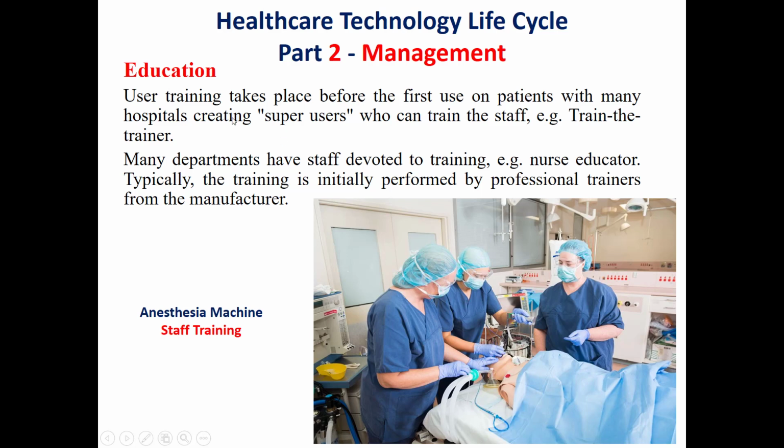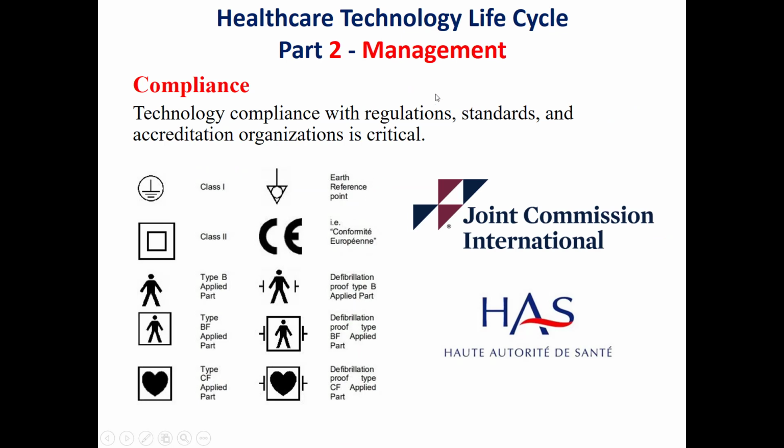Another point which also should be considered during the training, after the passing of the first year, we make what we call the competency test. The competency test is to assure that the user still has enough information about how to use this equipment or device. A second phase in the management part will be the compliance.